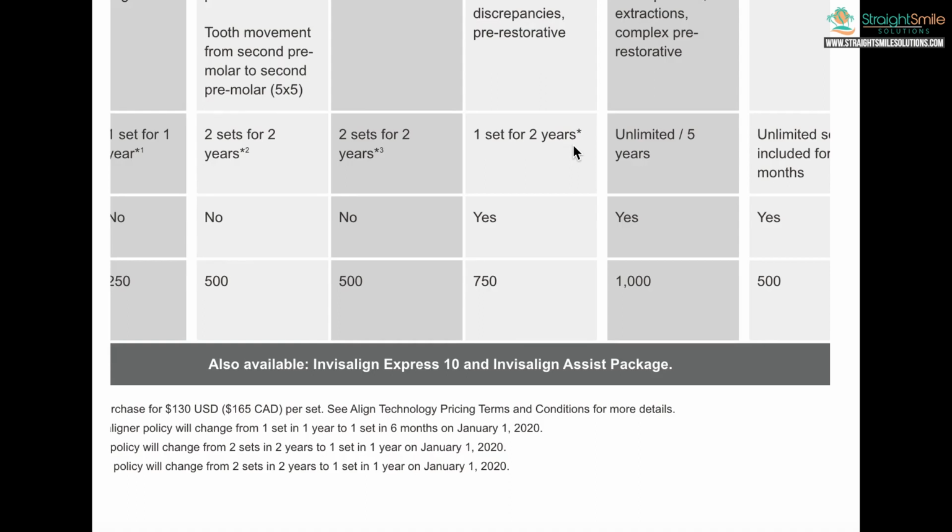This is very easy to do. It's not hard to set up a compliance system. Check out my other videos on that. But I think it's a matter of letting the patient know that, I would build this into your compliance contract. Honestly, they need to save all their old aligners. They need to be checking in with you weekly on changes, at least virtually through some apps.